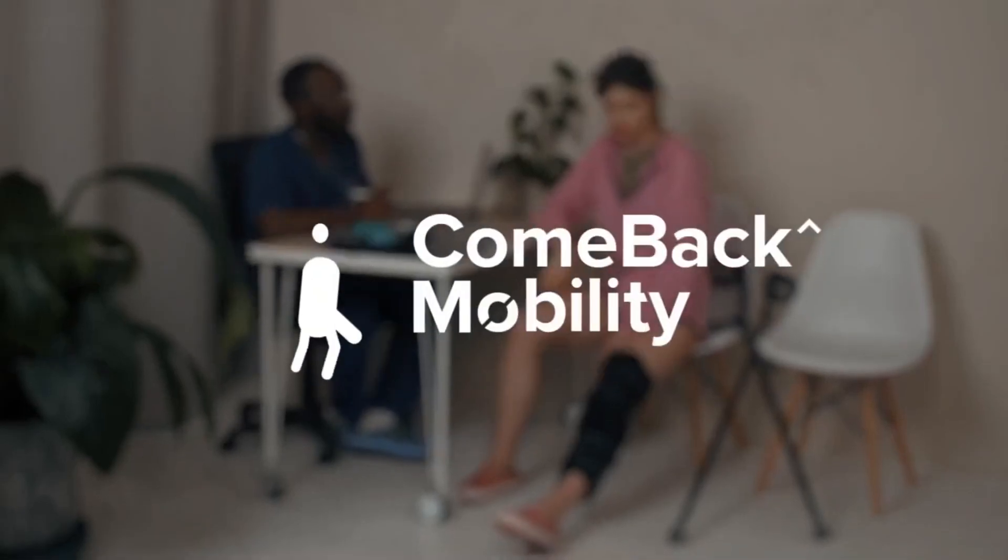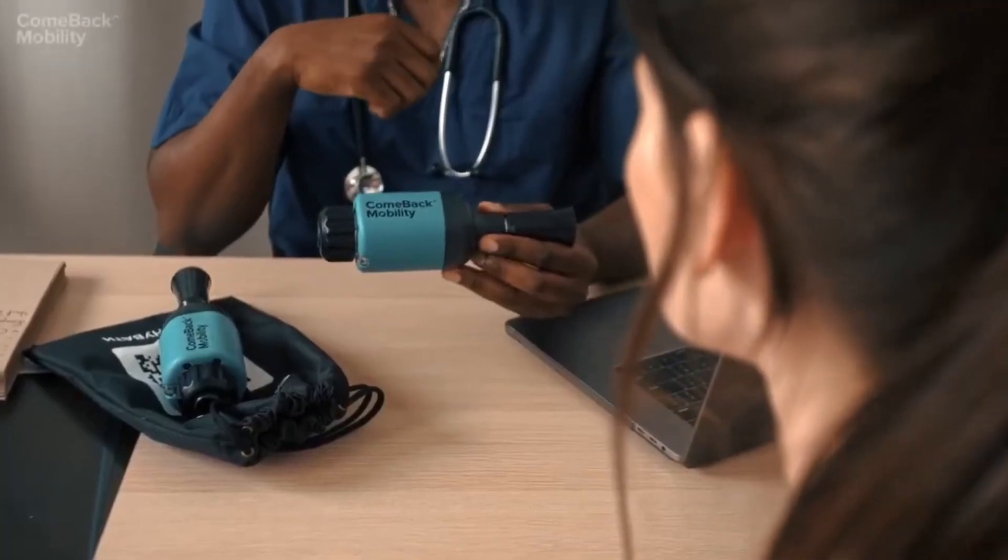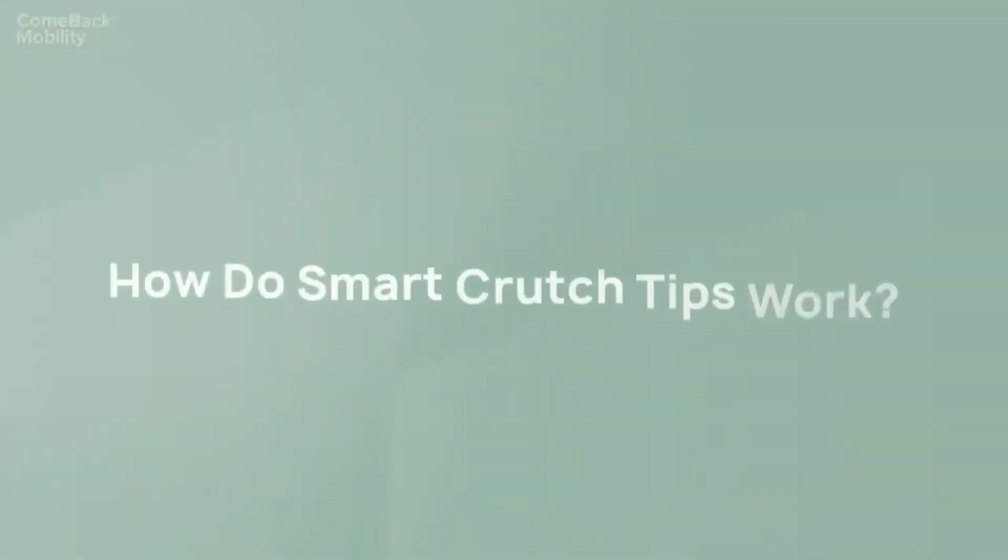Many lower extremity injuries have weight-bearing restrictions on the involved leg. Smart Crutch Tips provide an accurate and objective measure to achieve this. How do they work?